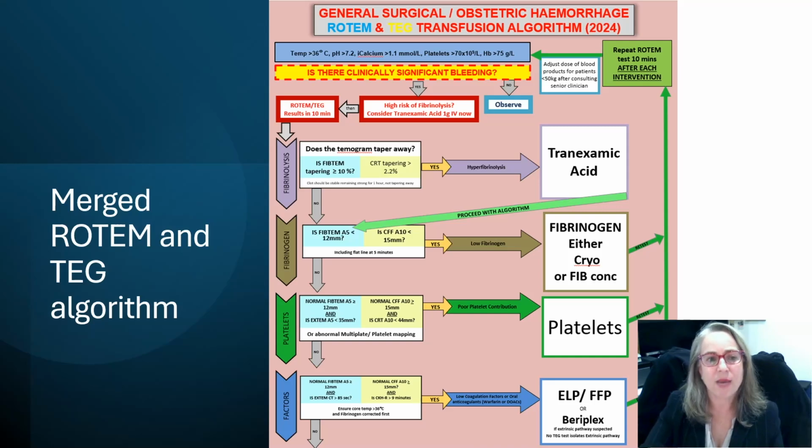Recheck your physiological targets, come back down the algorithm, make sure you're not now getting any fibrinolysis and that your fibrinogen is now normal, which it should be, and I'll show you on the next slide how we can actually prescribe the dose depending on how low that fibrinogen calculation is. I've just made this relatively simple to show you can go around the loops, down the loop, the fibrinolysis is not present on the left, the fibrinogen is good on the left.